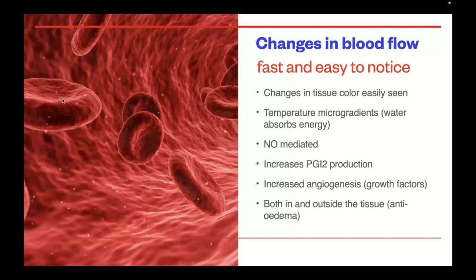But the increase in blood flow is not only in the short term, it goes beyond a quick vasodilation. Laser therapy also increases the production of growth factors that have a pro-angiogenic effect, like the vascular endothelial growth factor. So under the microscope, the tissues that have been treated with laser therapy in the midterm are richer in neovascularization. And the vasodilation that happens is both in the inflow and the outflow, so we have an anti-edema effect. It's not just more blood going into the tissue.